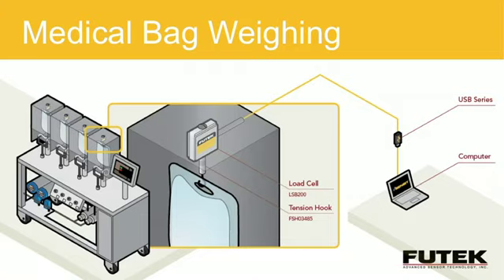Now, the other application for medical bag weighing involves the distribution of that medication, where I have the medication and I'm providing the solution to the customer, to the patient, and I'm metering the dispensing of the drug.